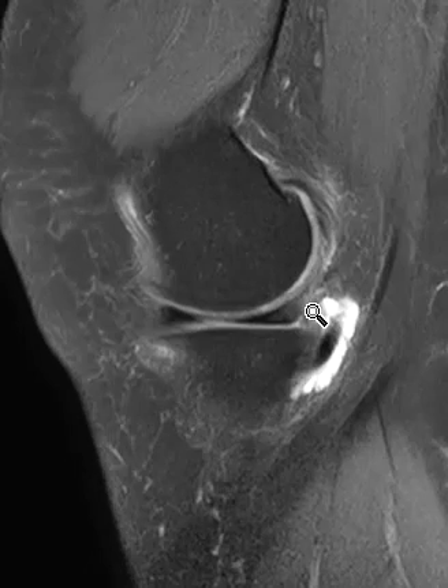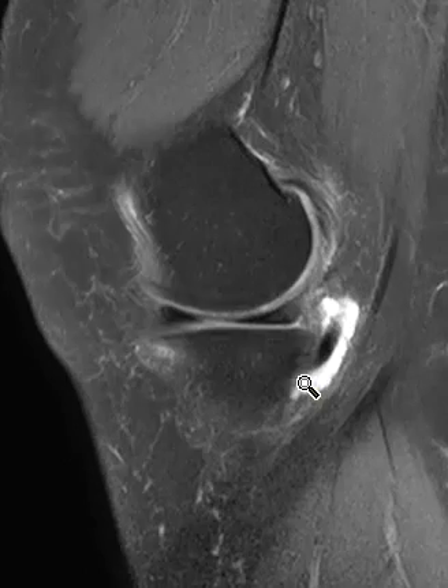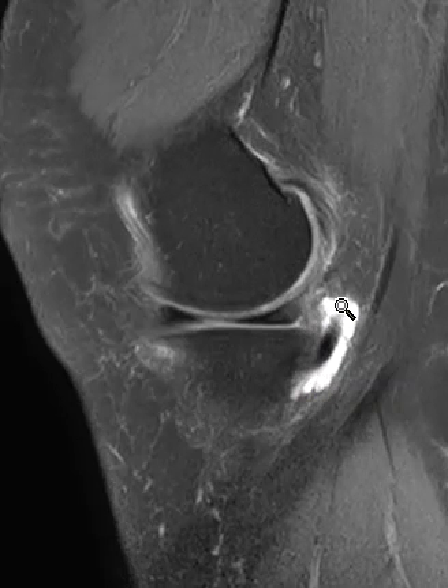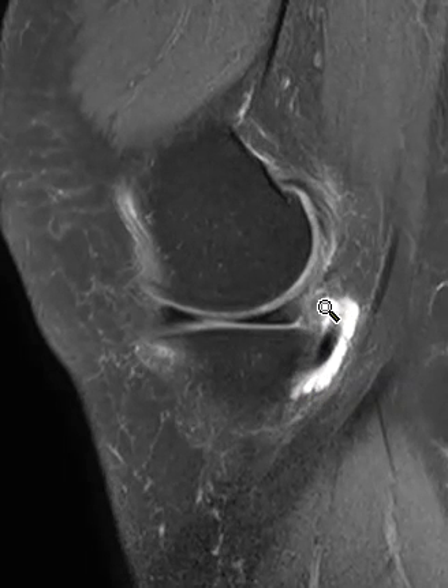If we go back over here, she has this comma-shaped fluid collection — fluid is white — and this surrounds a tendon called the semimembranosus tendon. This is an inflamed bursa, or bursitis. This is the semimembranosus tibial collateral ligament bursa.